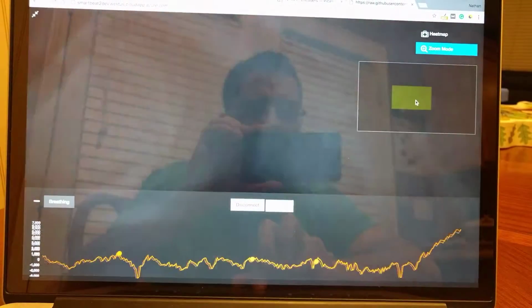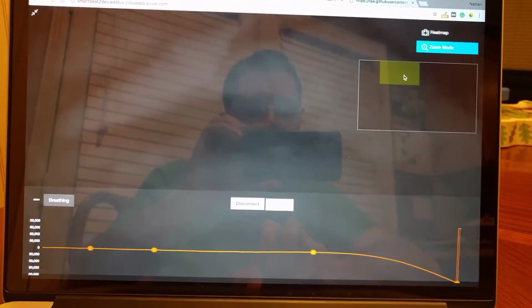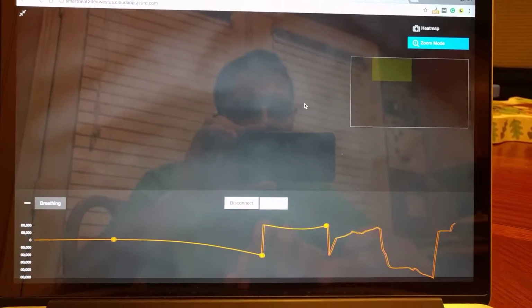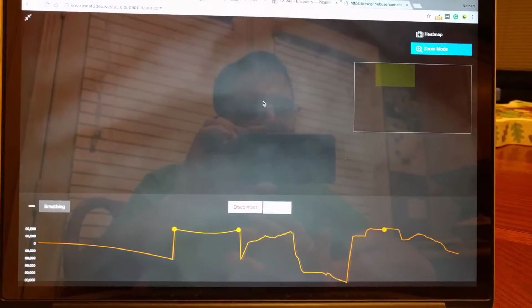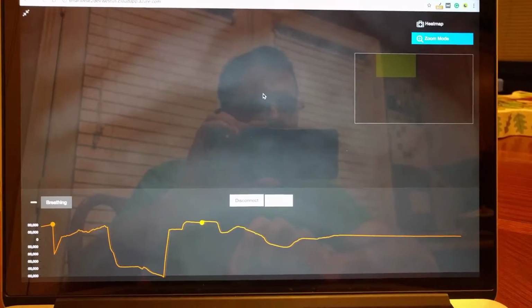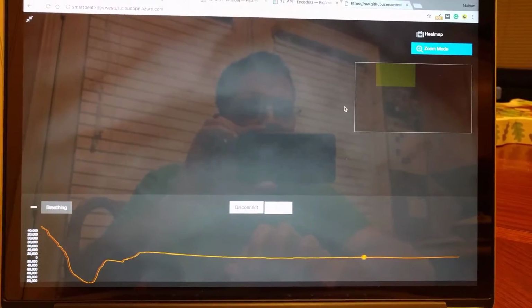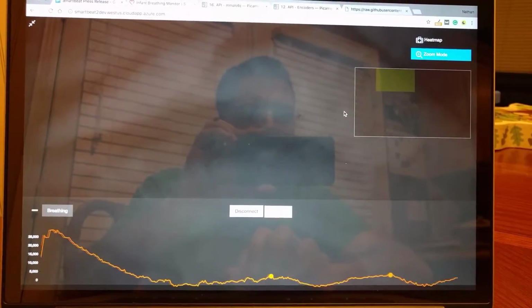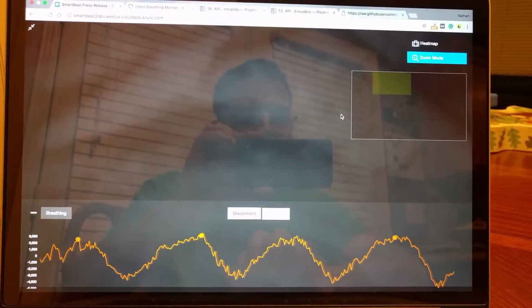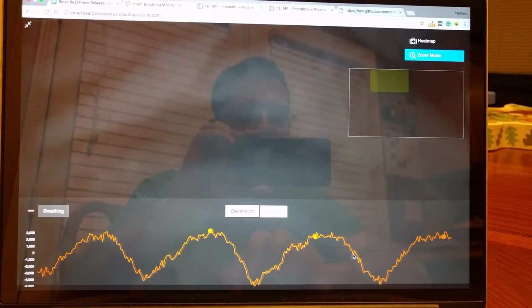And how this would normally work is the user would just tap on where their child's abdomen is, where you'd expect them to breathe, where you check on them breathing. And then you'd still have the full view of the image, but this is the easiest way for us to just run our processing for now, is to just simply drag around this box. So from this, I should see a much cleaner picture of the breathing, and sure enough, that's a lot easier to see those small lulls and breaths as they're being taken.